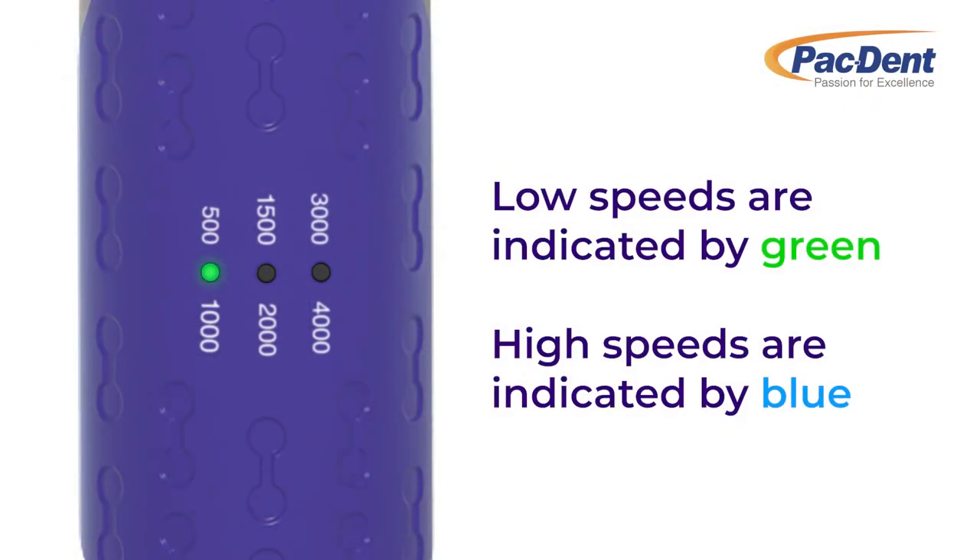The speed on the ProMate CL can be controlled by the handpiece at speeds of 500, 1000, 1500, 2000, 3000, and 4000 RPM, as well as on a foot pedal like a rheostat.